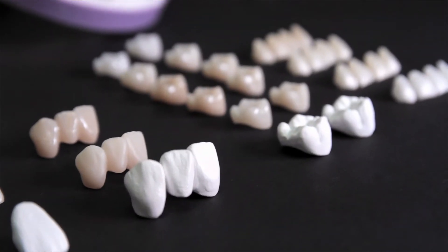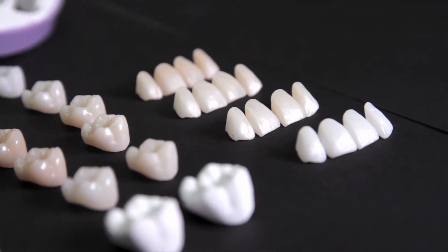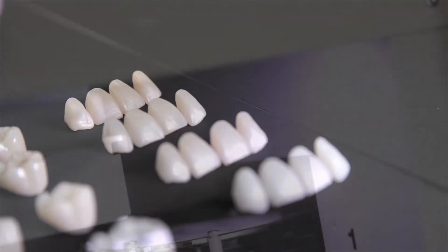And like other DG Shape dental devices, the DWX52DC is perfect for milling zirconia restorations.